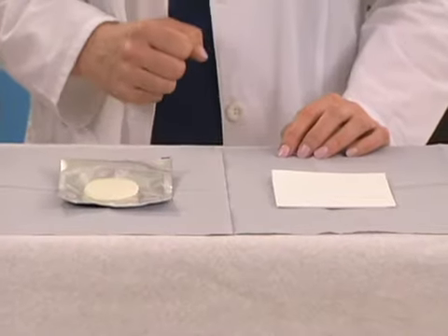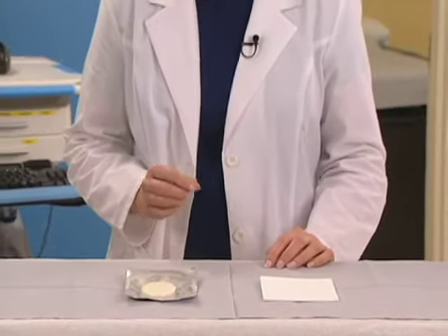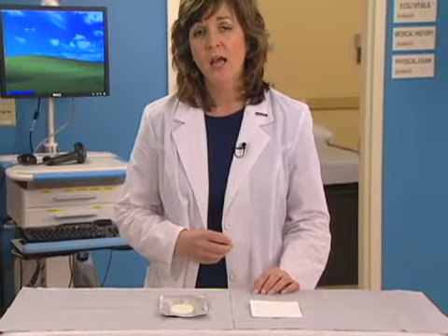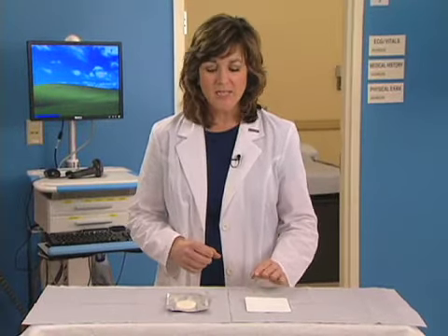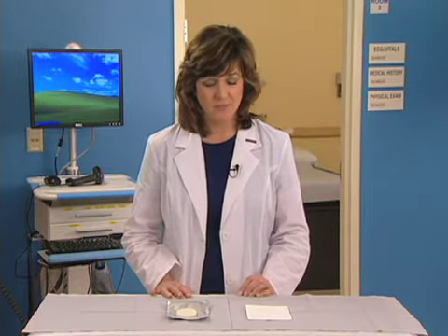These dressings are derived from natural sources and provide a healing scaffold or matrix that assists in the granulation and epithelialization of partial and full-thickness wounds. Biologic and biosynthetic dressings have been shown to achieve a higher rate of wound closure in difficult-to-treat wounds compared with standard treatments. Let's look at some examples of biologic and biosynthetic dressings.